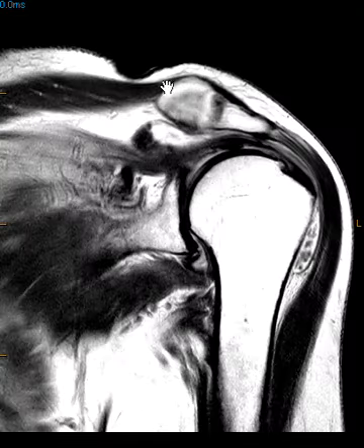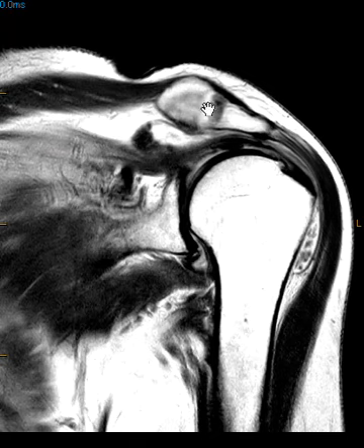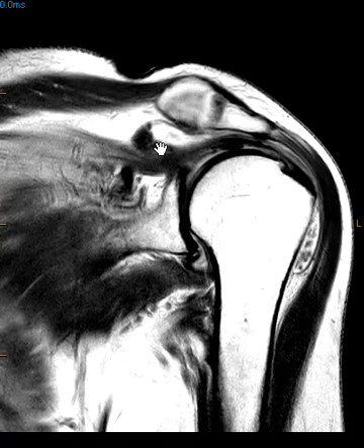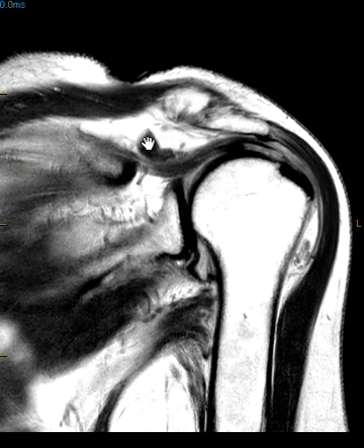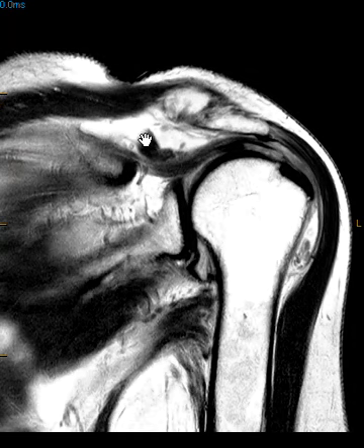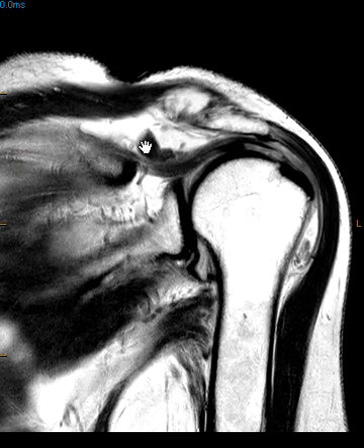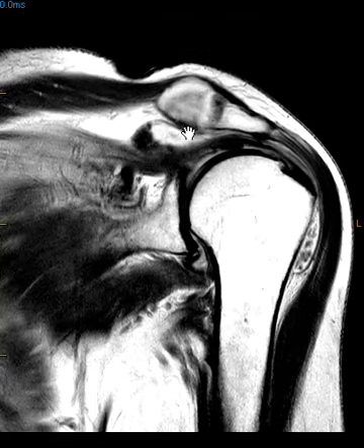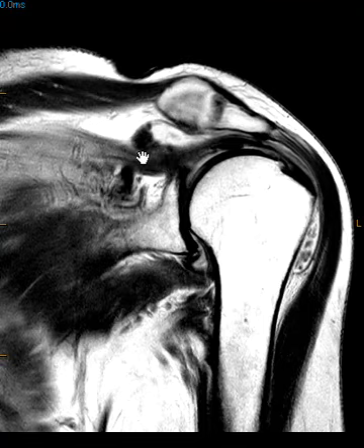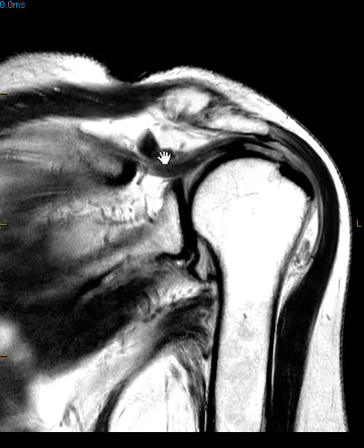Over here along the medial side, this is the AC joint — there's fluid in the AC joint, that's why it looks so abnormal here. Below that, this is part of the bursa. There's this glob of darkness here, which is a synovial pseudomass — a more prominent localized region of synovitis within the distended bursa.